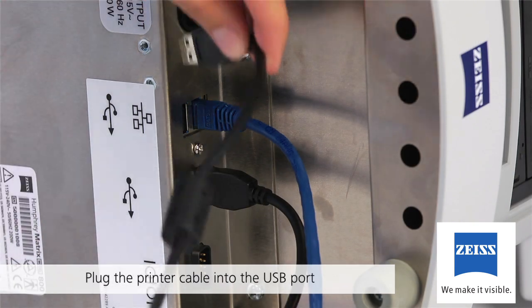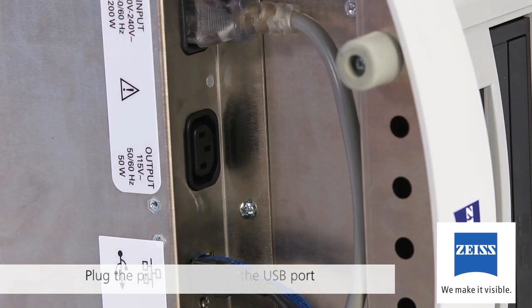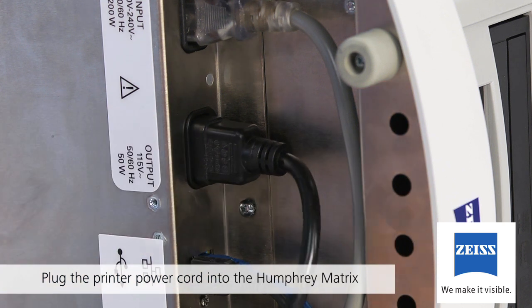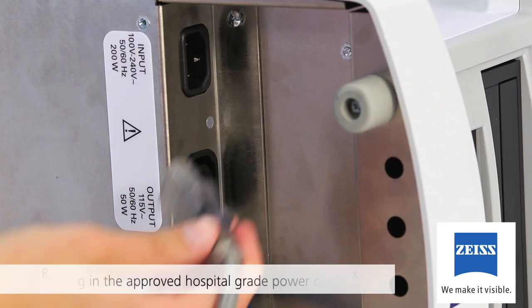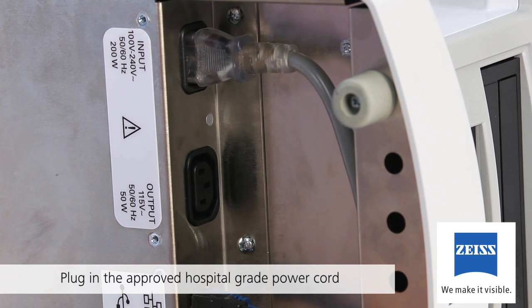Plug the printer cable into the USB port next to the network port as shown. After this step, plug the printer power cord into the Humphrey Matrix power output receptacle. To meet medical safety requirements, the supply printer must be powered from the instrument. Finally, plug the approved hospital-grade power cord into the input receptacle on the instrument. Be sure all connections are fully seated.